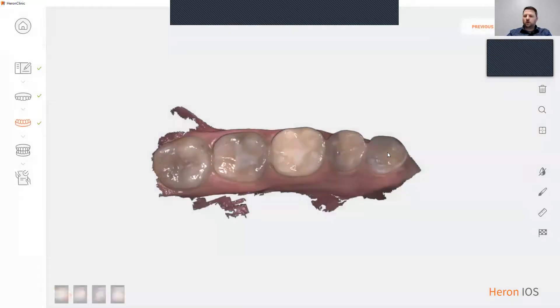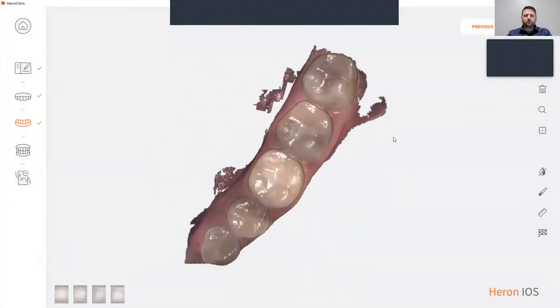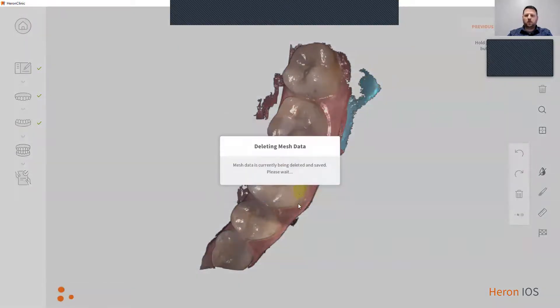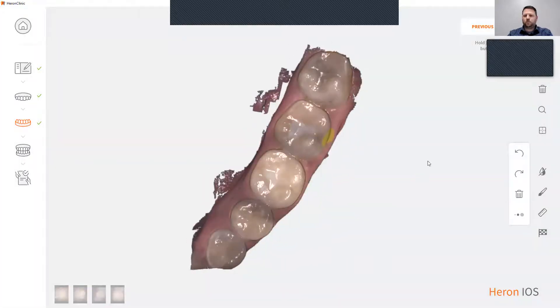Our software does offer a few tools. You have our erase option. To do such, simply click on the paint brush, highlight the area that you would like to erase, hit the trash can option, click OK, and that will erase that part. We have a measuring tool as well. Simply click the points that you would like to measure and that gives you your measuring distance.